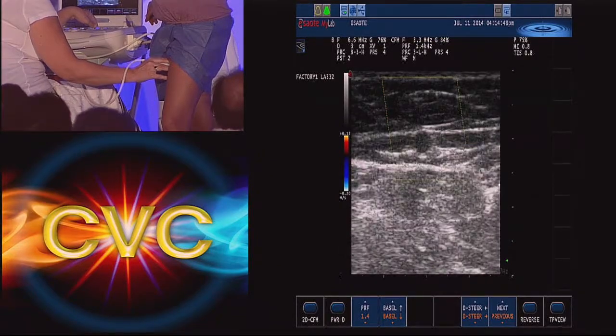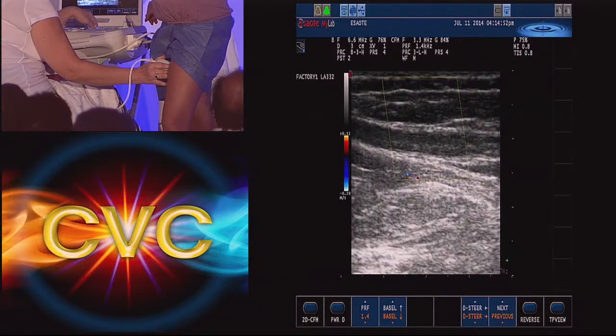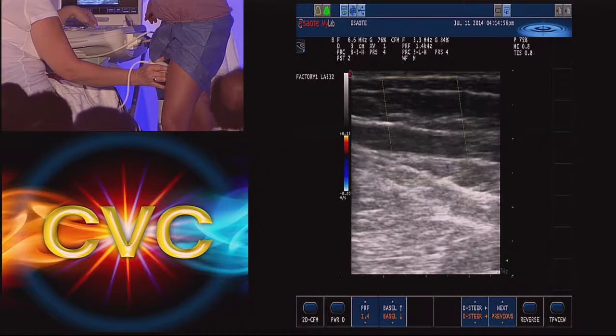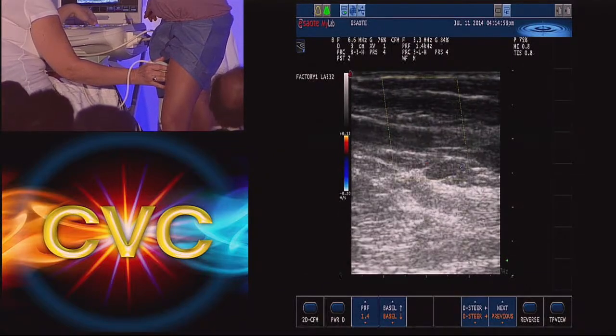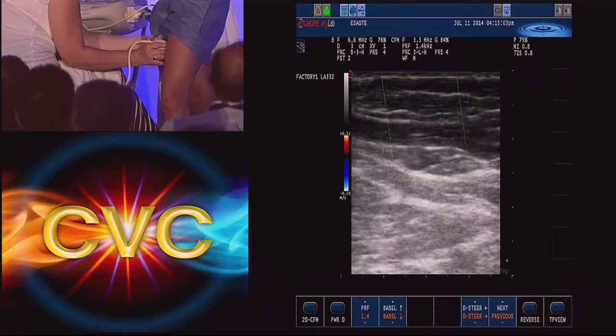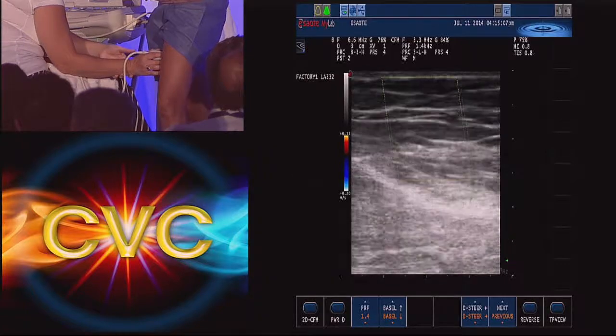She's now in the proximal thigh, right there. That's a normal young, if it's cold, we'll have vasoconstriction. Anxiety, vasoconstriction. All those things add to it, and you can see that dehydration, vasoconstriction. Are you nervous? A little bit. Not really. Okay.